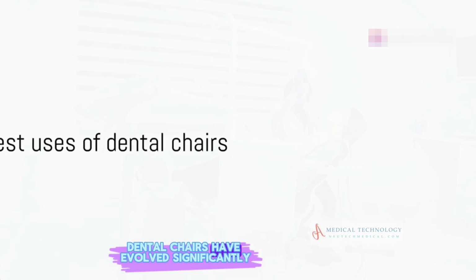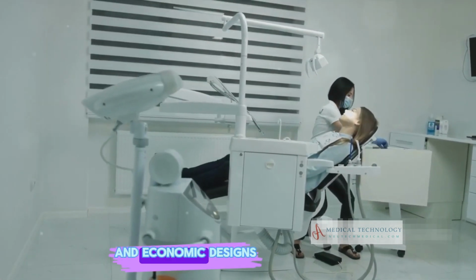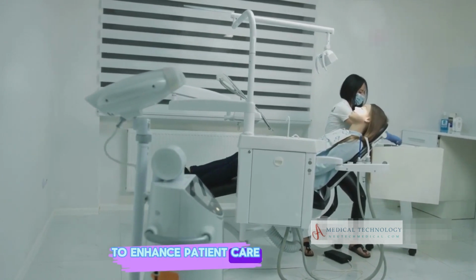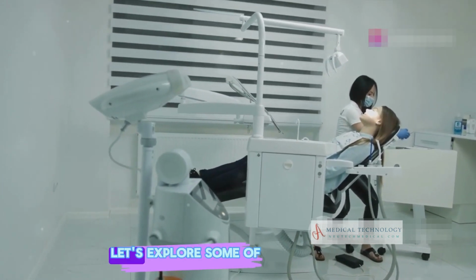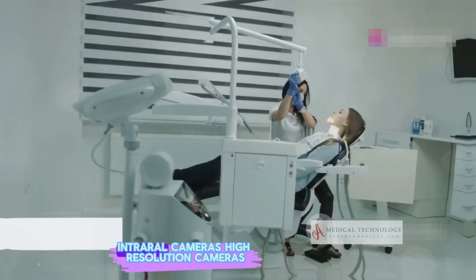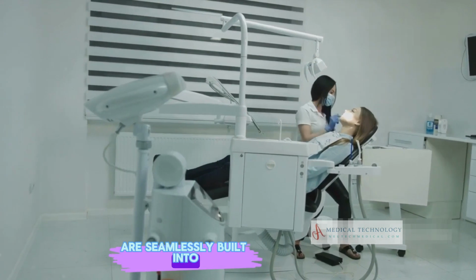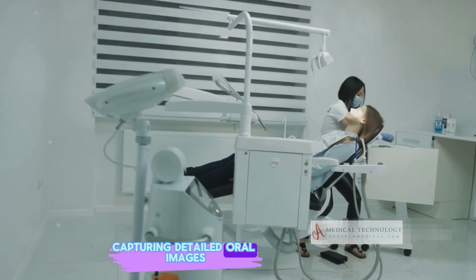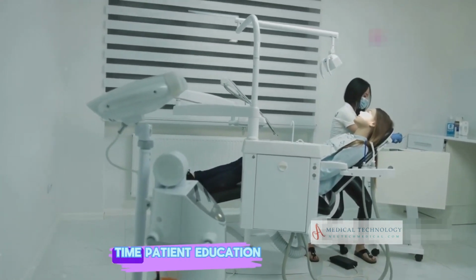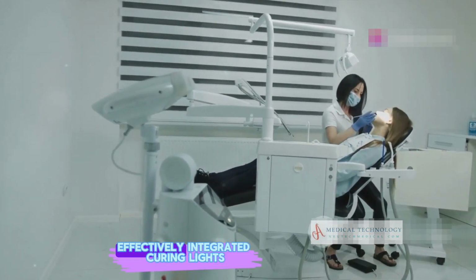Dental chairs have evolved significantly, integrating cutting-edge technology and ergonomic designs to enhance patient care and clinical efficiency. Let's explore some of the latest uses and innovations in dental chairs. Intraoral cameras. High-resolution cameras are seamlessly built into dental units, capturing detailed oral images. These images aid real-time patient education, allowing dentists to explain treatment plans effectively.